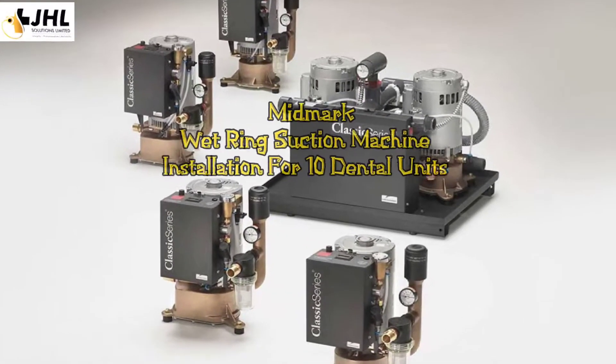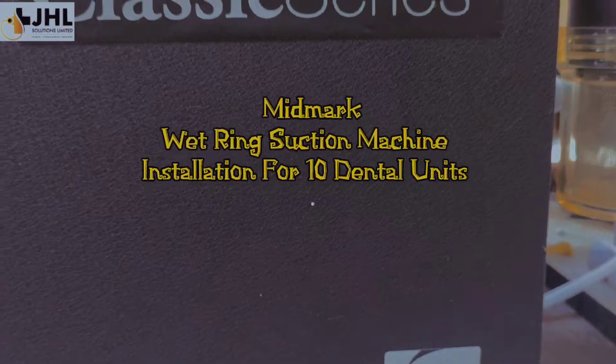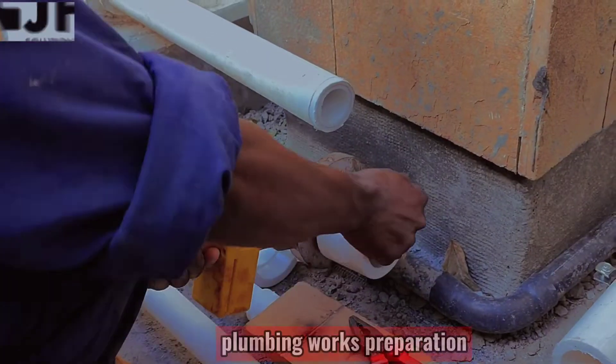Midmark wet ring suction machine installation for 10 dental units. Plumbing works preparation.